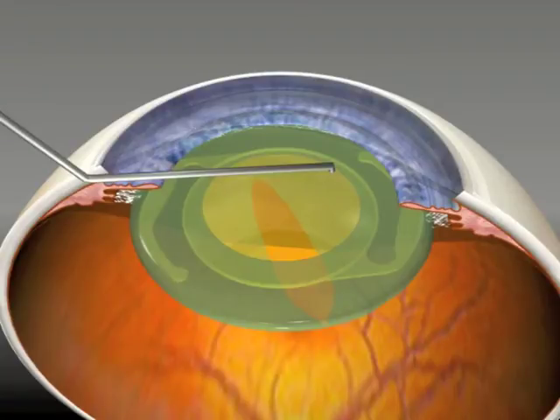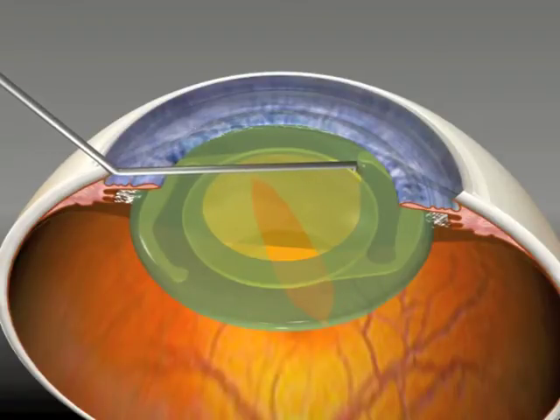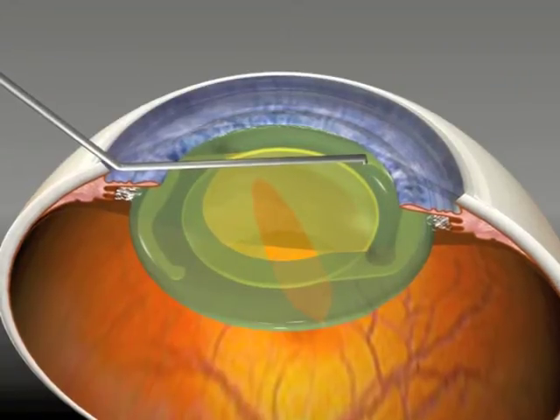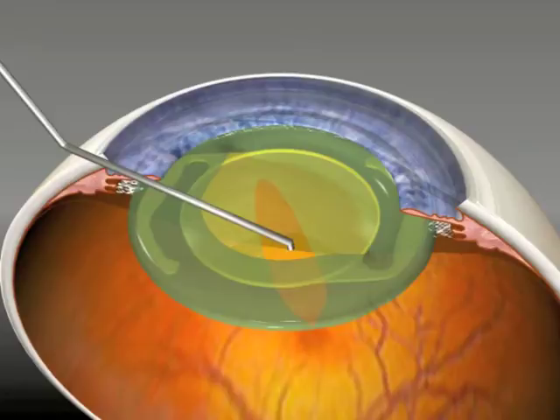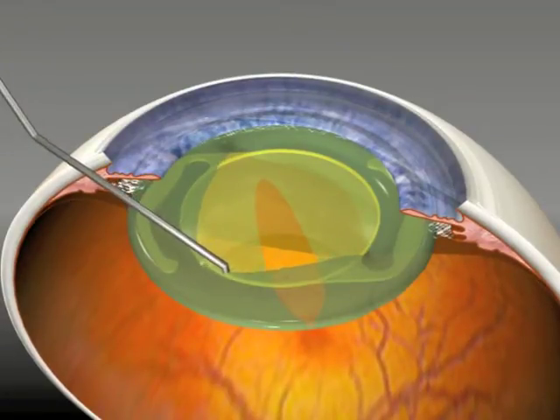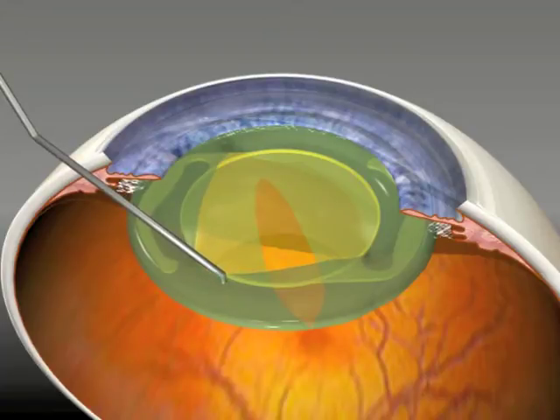This is a technique I call reverse rexus fixation to be used in the event that a posterior capsule tear occurs after the lens is in the bag where the optic is pulled out of the bag to be fixed by the anterior capsule rexus.